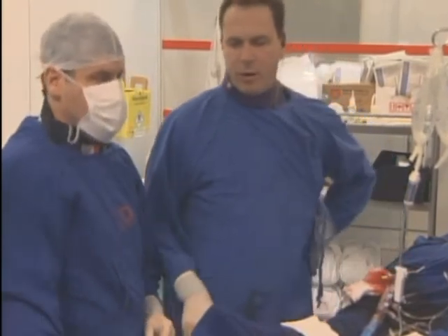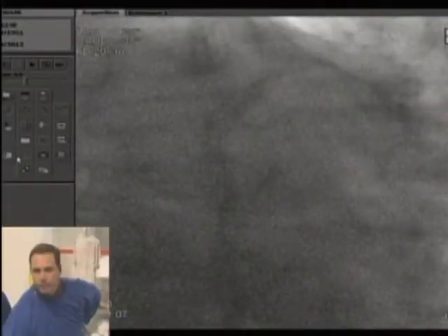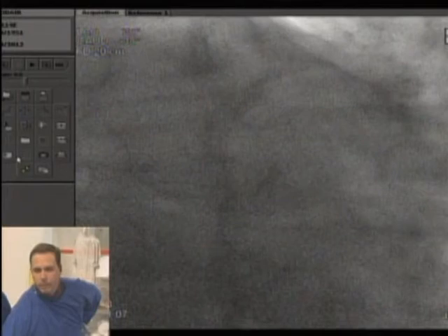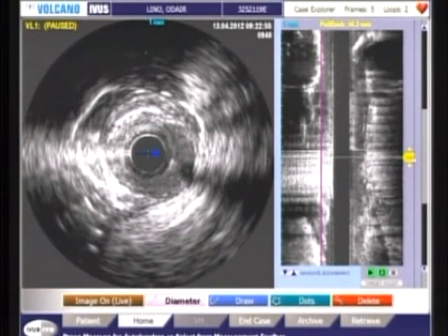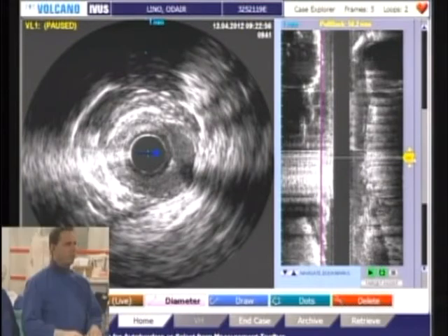Yes, very much. I mean, 12 years ago we didn't really know much about these high pressure things. And I'm just wondering, with bare metal stent restenosis, there's always a possible reason of underexpansion of the deployed stent. Yeah, the mechanism of restenosis there is perhaps a combination of lack of expansion and intimal hyperplasia, because there is tissue inside as well. But that new lesion really is outside the stent, so you also have that ostial lesion at the proximal edge.